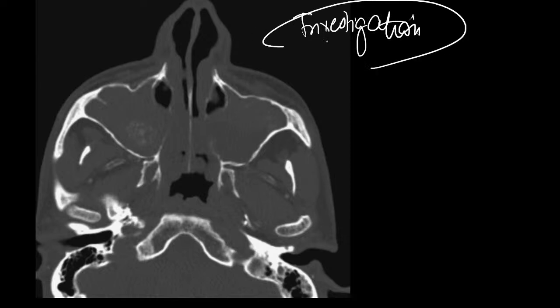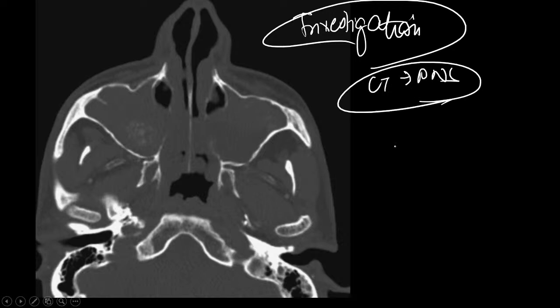Okay, identify the investigation in this case. Come on, guys, which investigation is being shown to you in this image? Oh, very good. This is a CT image. Okay, CT image of the PNS. Okay. And what do you see in this CT image of the PNS?